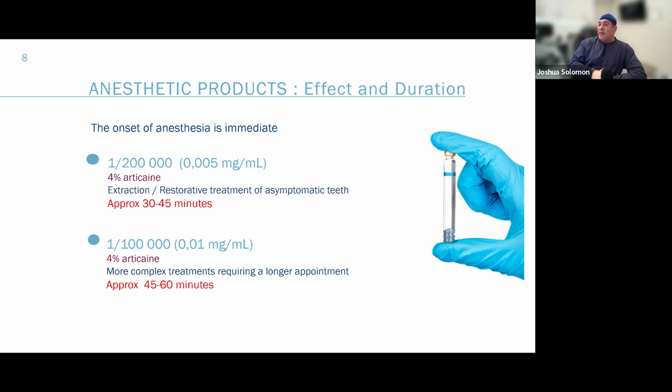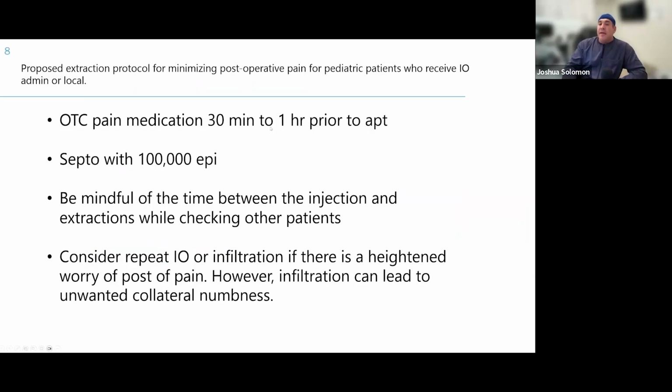That's one of the greatest ways of not having your patient taste anything, because we know sometimes that can take our appointment and make it very difficult. They may not feel anything, but it may taste bad to them. Put your Isolite in and just go ahead and give your injection. You start working right away. I typically put the Isolite in at the very beginning of the appointment. It comes out when I'm done with that quadrant or if I'm moving to the other side.